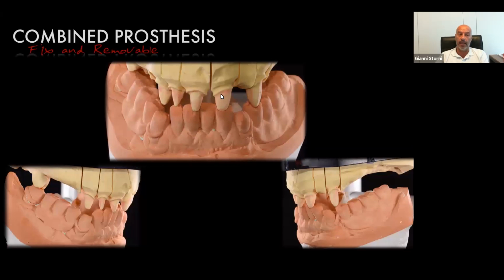Now, this is another case, for example an anterior group of teeth, where we make a preparation of the anterior teeth. We are setting up the articulator. This, for me, is something that I was in touch about this week with Catherine. I hope that Catherine is connected, or you can see later on, because she was looking forward to seeing how this attachment works.